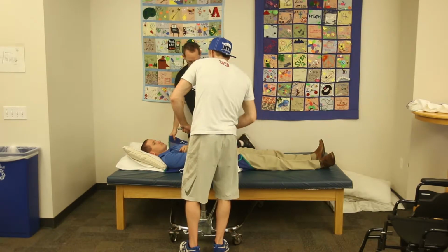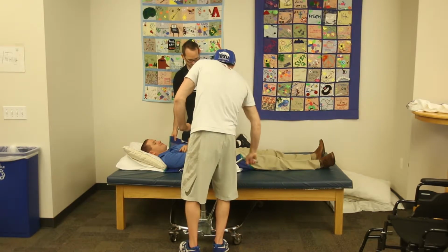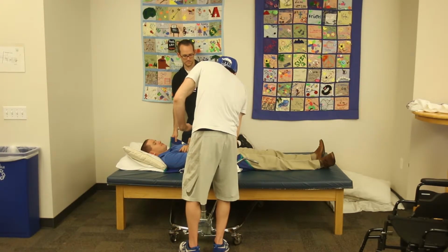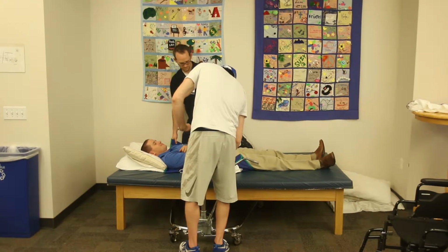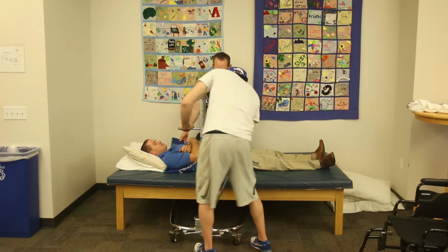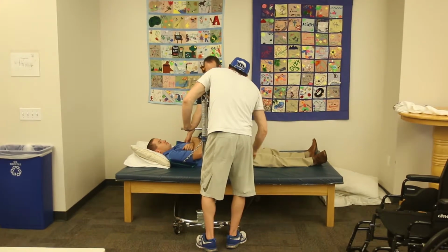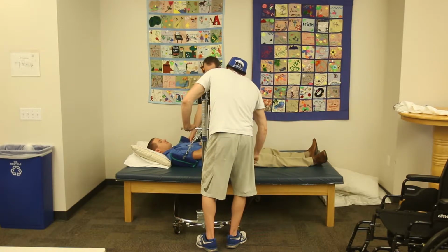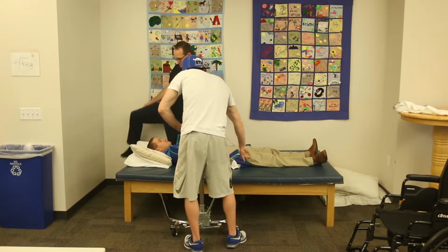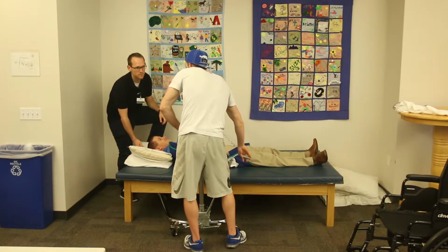And we're going to lift you up just so that you're just off the table. So we're not going to suspend you 10 feet in the air or anything. So just a free little ride. I should probably lock it first. That will help. Okay. And then Lucas, now that we're starting to get to the point where his head's coming off, do you want to support that head and that neck?